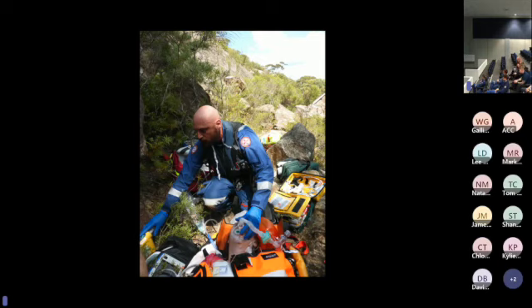And essentially, we came up with an Oxy Sock 2, which was a way of delivering the ventilator and the oxygen supply on the winch hook to a scene. But as I said before, we certainly use this in our road vehicles, and we certainly use it in Orange as well as non-winch bases. So that's sort of where the need came from, right?